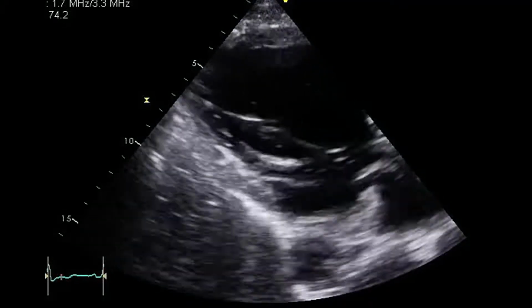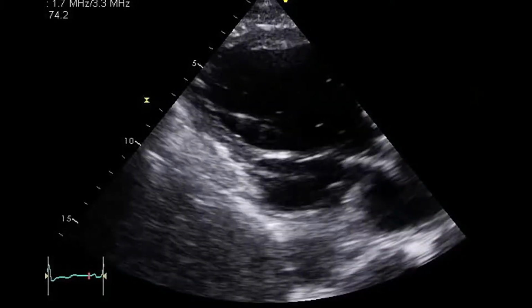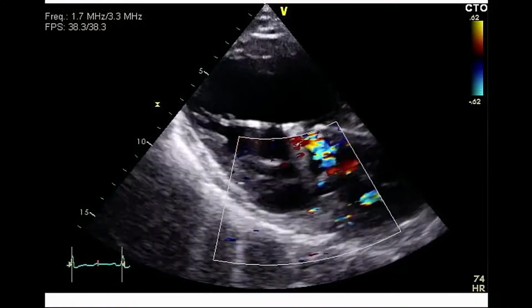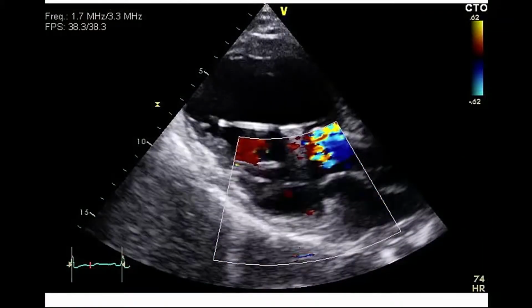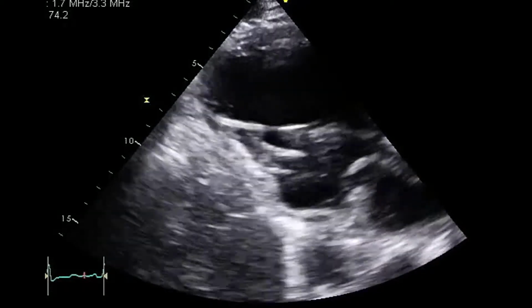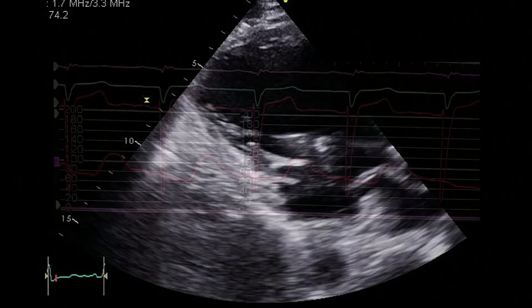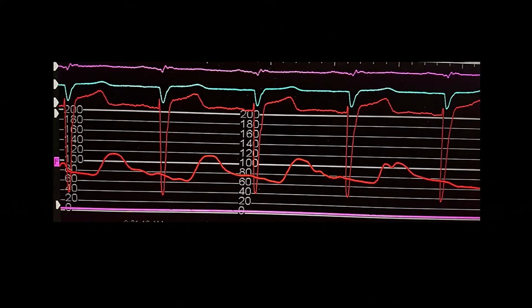And as you can see, the Impella at the initial site was probably too far in. Then we repositioned it, and you want about 4 centimeters below the aortic valve, and this is about what it is. And this is the blood pressure that we had post-Impella positioning.